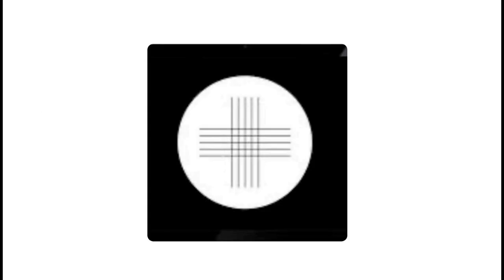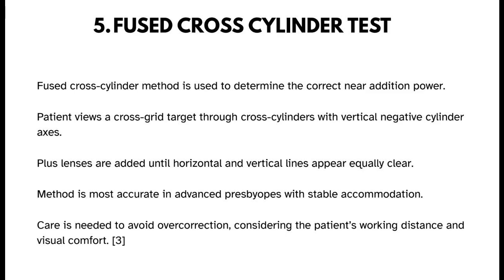Next, we have fused cross cylinder. In fused cross cylinder, the horizontal lines and the vertical lines are compared. To perform this test, the distance correction is placed in the trial frame, and the JCC is aligned with the trial frame at 45 degrees, and the red line will be at 90 degrees. The subject is instructed to identify which lines appear more sharp and clear, adding plus lenses until horizontal and vertical lines on the cross cylinder grid subjectively appear equally clear.